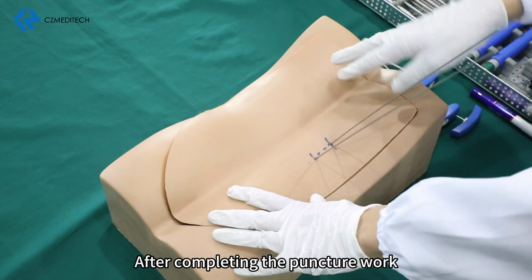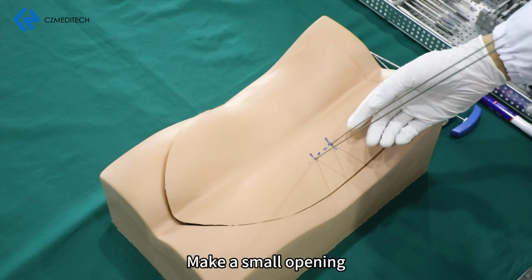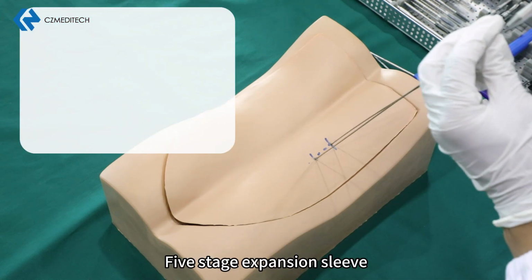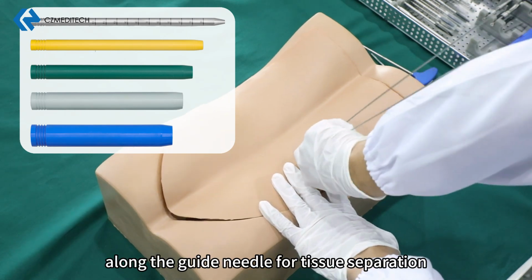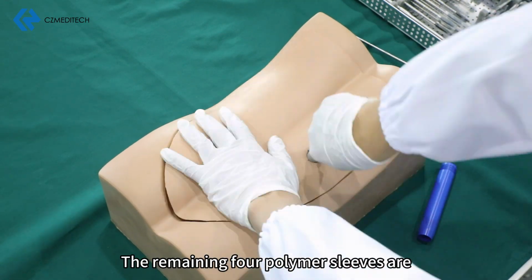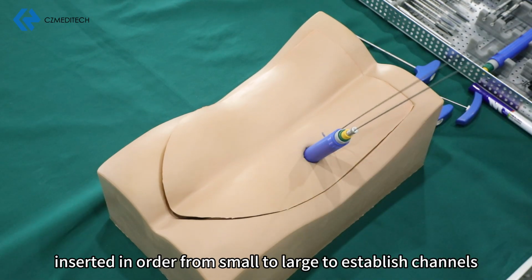After completing the puncture work, the soft tissue was separated and expanded. Make a small opening in the skin along both sides of the guide needle. 5-stage expansion sleeve. The first stage metal sleeve is inserted into the skin along the guide needle for tissue separation, and the sleeve is inserted into the pedicle surface. The remaining 4 polymer sleeves are inserted in order from small to large to establish channels.